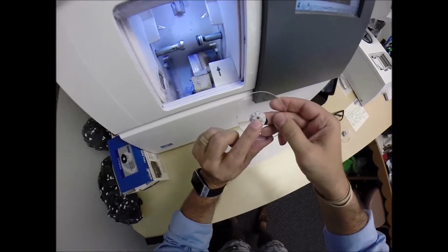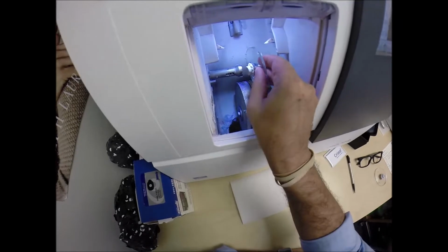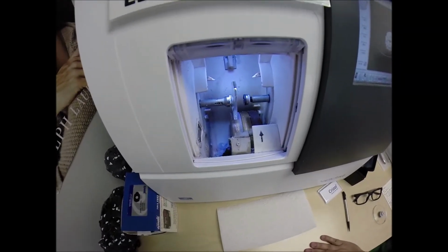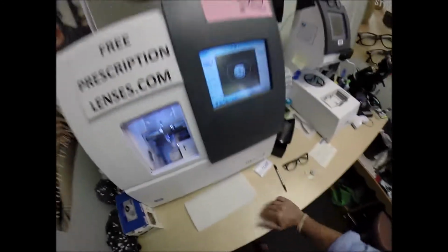Now the magnet's going to do its job a second time. It's going to attach itself to another magnet into the chuck, or by now, you know I like to call it the Charles, because I just don't know this machine well enough to call it Chuck.